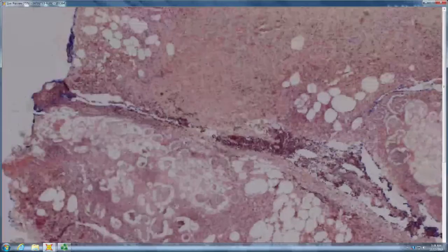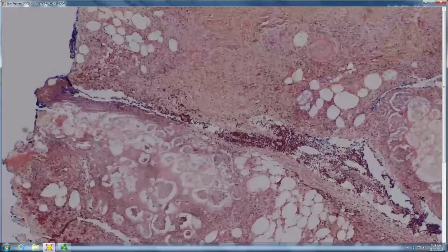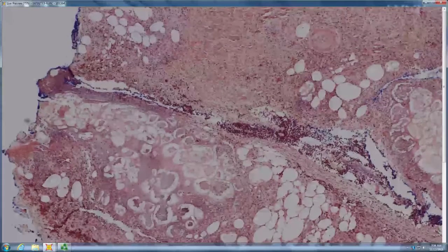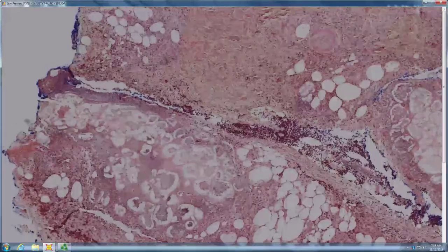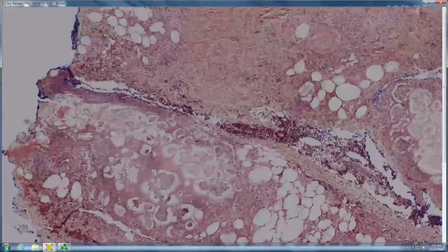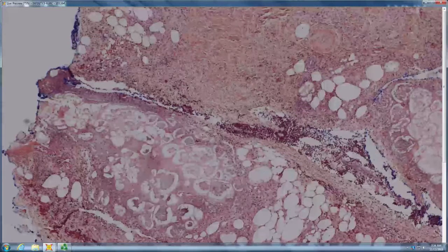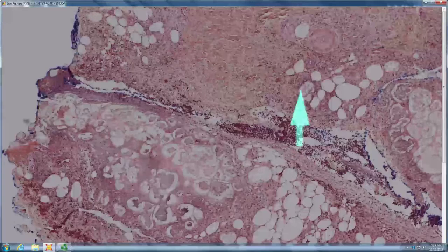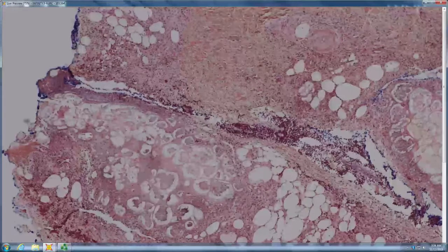A lot of blood, a lot of, is that saponification in there? Got some pancreatic panniculitis. It looks exactly like pancreatic panniculitis, and you even get, for Jeopardy, since you phrased it in the form of a question, you get extra points, right? So that absolutely looks like pancreatic panniculitis with saponification and ghost cells.